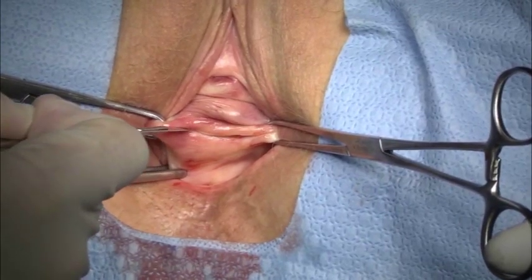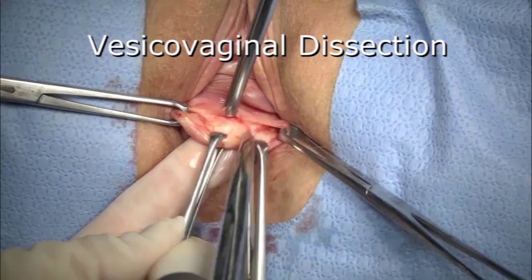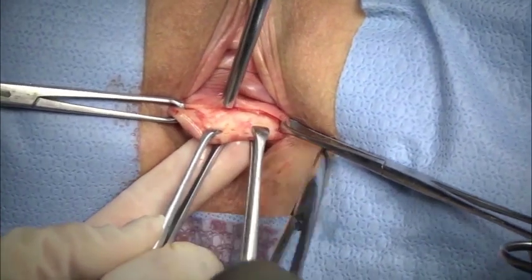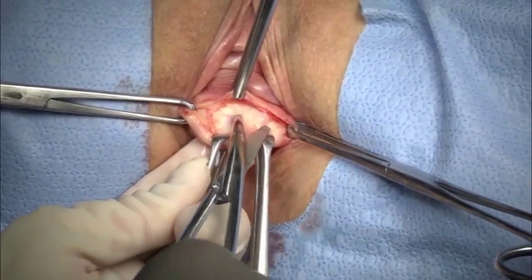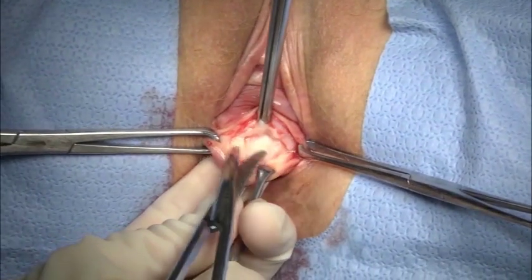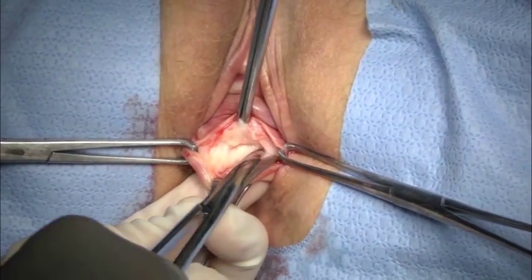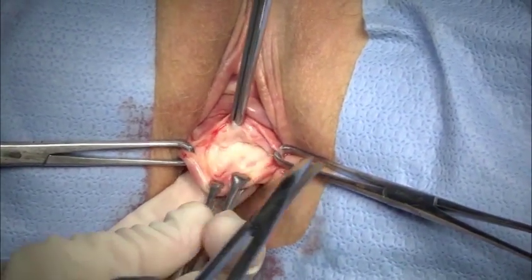Hydrodissection is followed by a horizontal or midline incision. Here I made a horizontal incision at the level of the bladder neck, followed by dissection of the vesicovaginal space in the standard fashion. The left index finger is used to guide the thickness of dissection and to monitor for appropriate thickness of the vaginal skin flap.